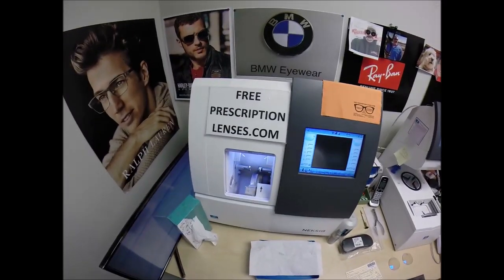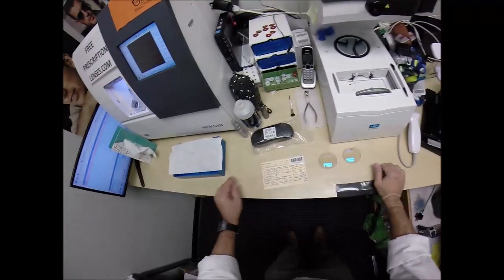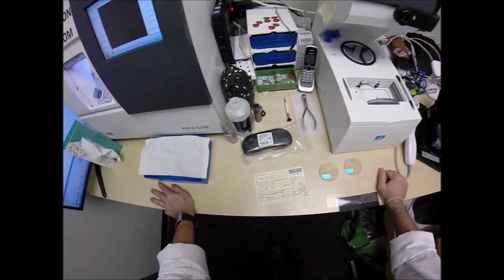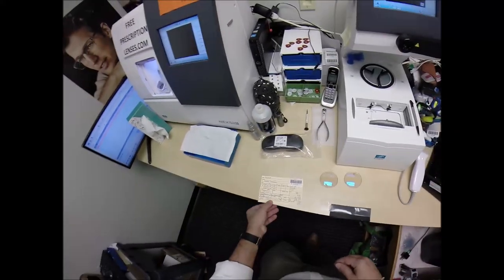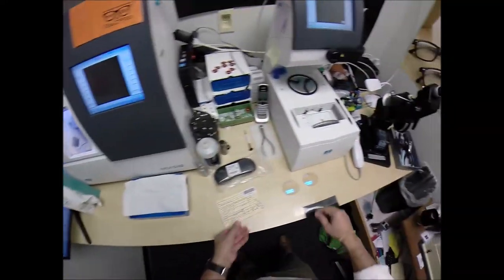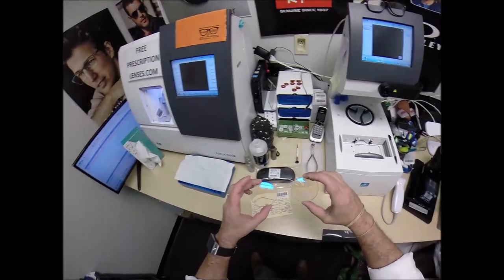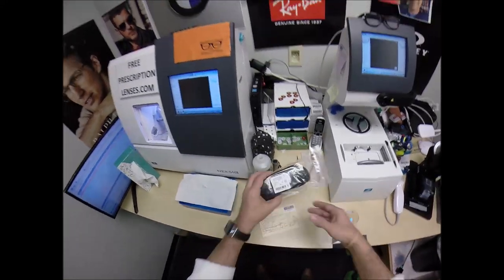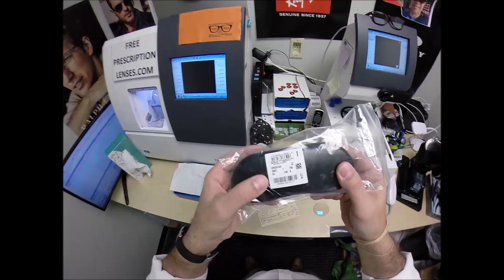See more better with freeprescriptionlenses.com, but call me Mo Mo Better because I'm going to have you seeing Mo Better, looking Mo Better. I'm also going to show you how I bring that loving feeling back to glasses when I cut an Essilor Ideal Advanced Transitions Extra Active with the blue flash mirror for Brian's Ophthalmic Clubmaster.